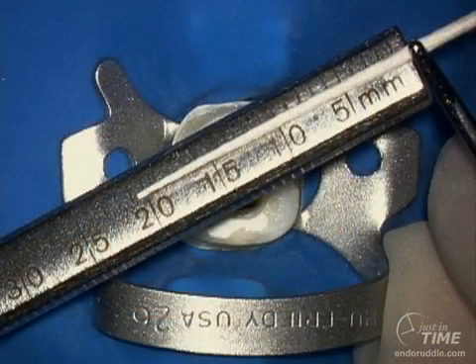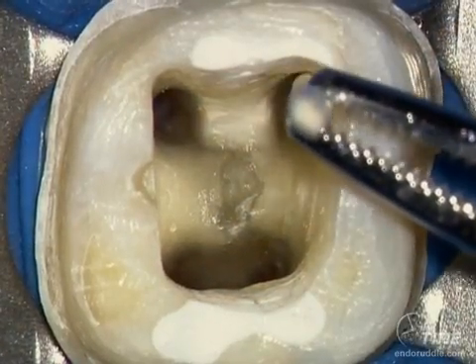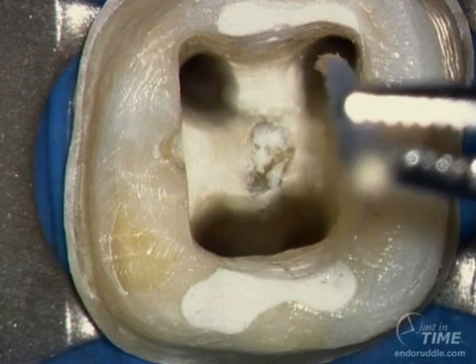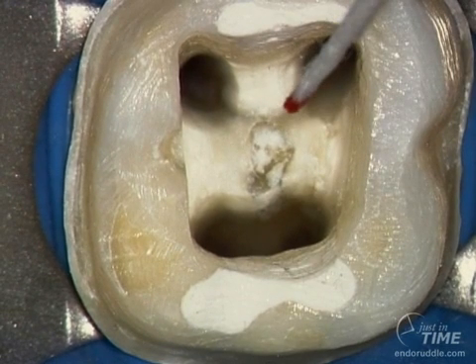We can even set the point at another half millimeter longer than we just showed, and sometimes this will move through the foramen and it'll come out with a little bit of a hemorrhagic exudate on its terminal extent. That part of the paper point that is completely dry consistently represents that part of the paper point that is confined to the root canal space.